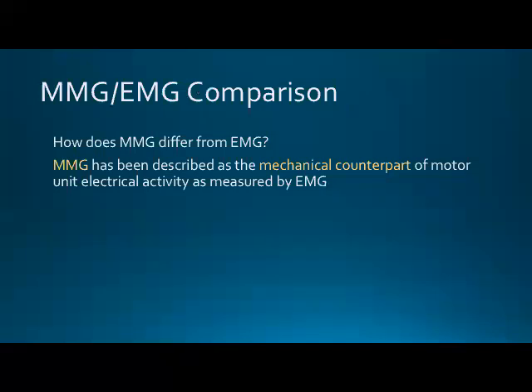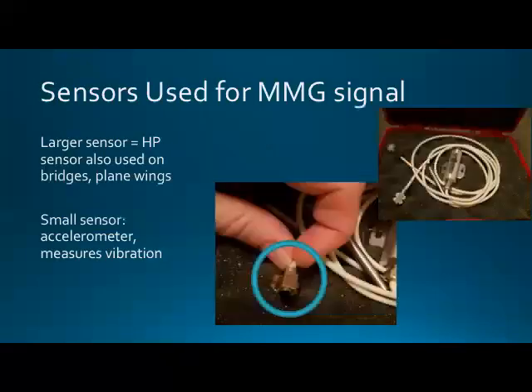What do these sensors look like? So I'll bring my MMG sensor. They cost like $2,000, so we're not going to use them just because they're so sensitive. Like, I've broken them in labs, and then you have to send them to France, and it takes like a year to fix. So in our current economic situation, I am not going to have us use these, but I will bring them so you can check them out.